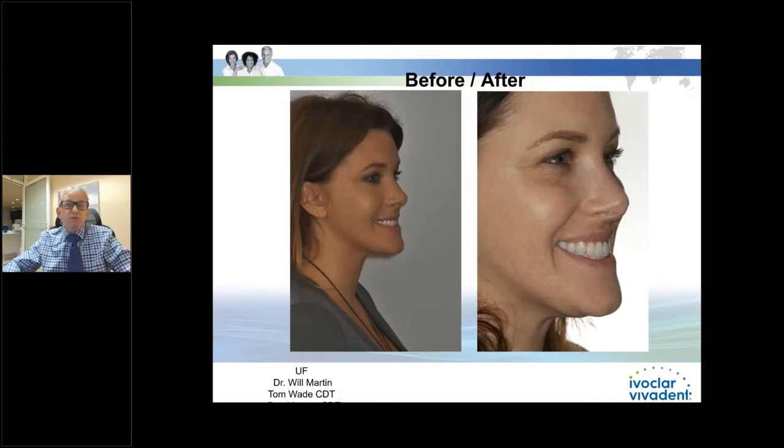Looking at her from a lateral view, look at the smile. Now notice her chin. She is actually a class 3 skeletal patient, but yet we have her in a class 1 occlusal setup. So this is one of those things where you don't always have to do a patient in a class 3. And she was already in a class 1 with her previous all-on-4. And so she was adamant that we were going to put her back in this position. So we did. And again, you can see how nice the profile looked. The communication was really good here also.